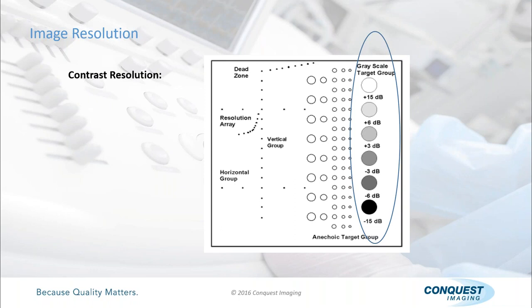What's the requirement? All probes. And why? Because different frequencies have different resolutions, right? So you need to evaluate that probe for its set of frequencies. And then you put a different probe on or select a different probe with different frequencies, and you also want to evaluate that one.